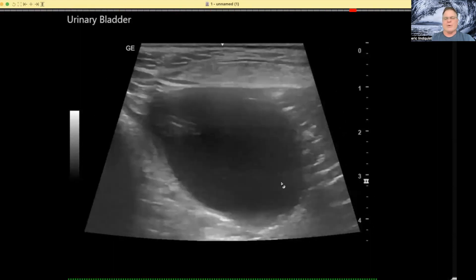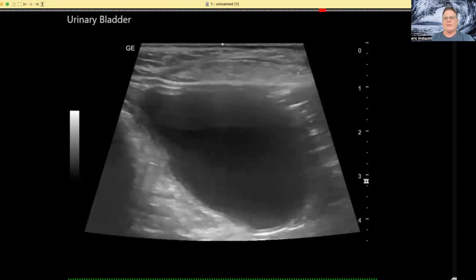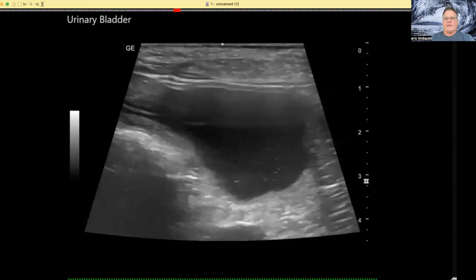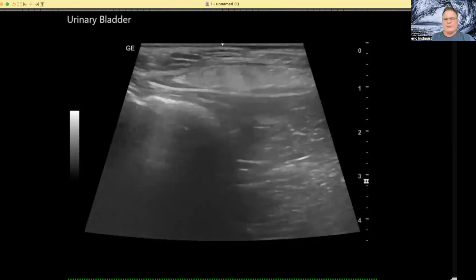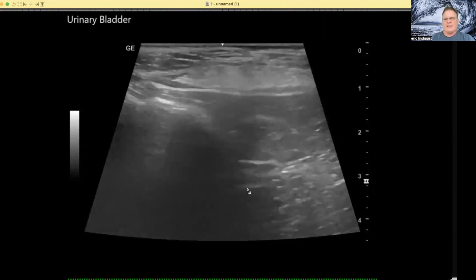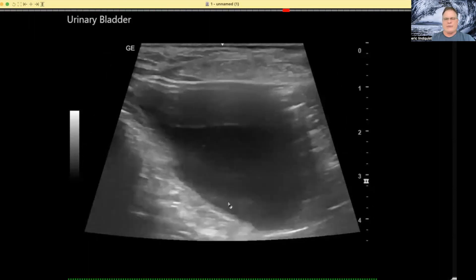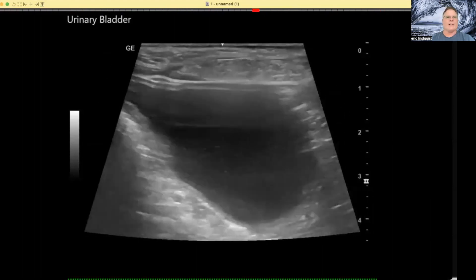More often than not, there's no other comorbidity going on to cause the clinical signs unless there's maybe a UTI or something like that. Here we see a colleague who did the S-DEP protocol as prescribed and went through our course and is doing very nice work. Here's the bladder — adjusting the depth here, maybe a little bit short on depth, but using high resolution imaging because they already did the full S-DEP, and since the clinical signs were urinary tract, the colleague utilized higher resolution to get better detail on the urethra and bladder wall.